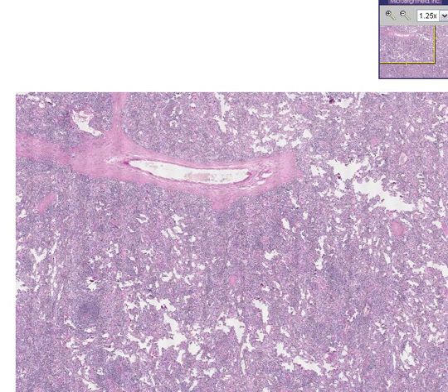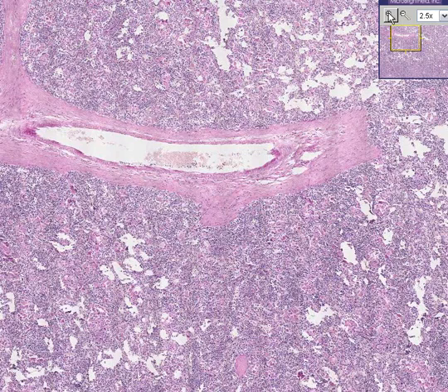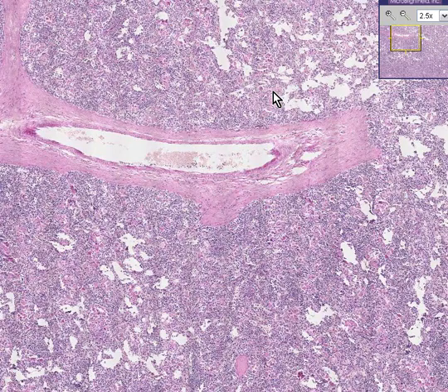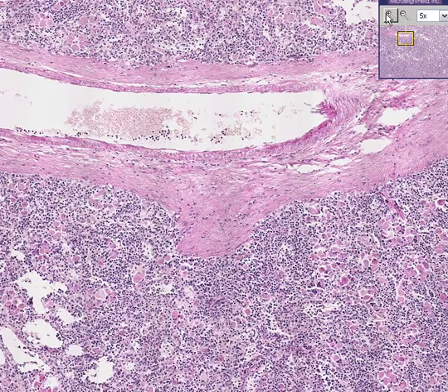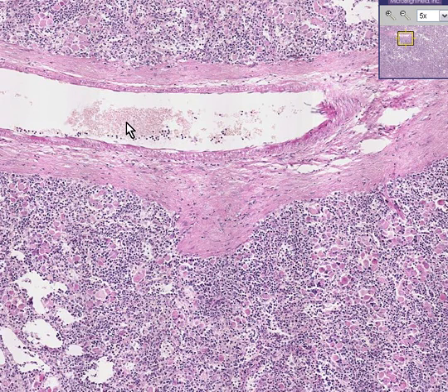Can you recognize this as being spleen? Perhaps you can, because you can see that there is a large blood vessel running within this fibrous trabeculae. You know it's a blood vessel because you see smooth muscle and a lot of blood on the inside — red cells here, white cells here.